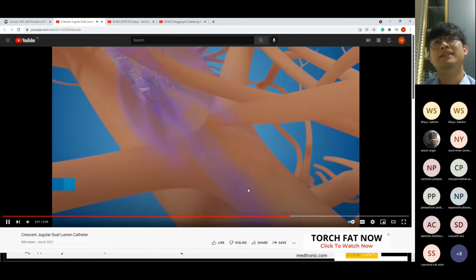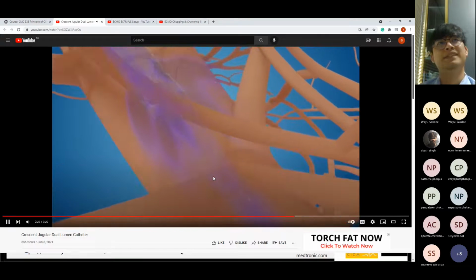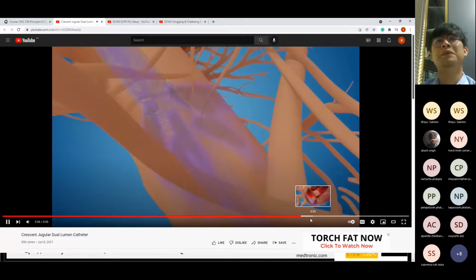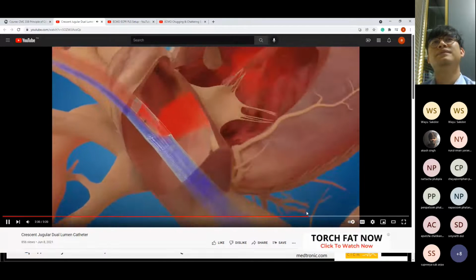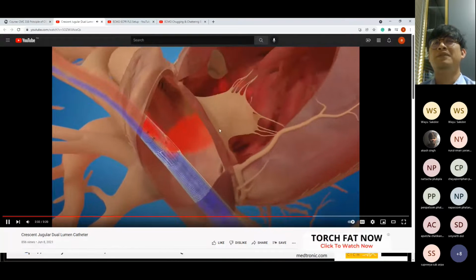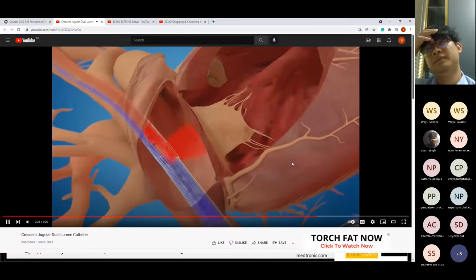And it's just the design that they show, that it's good drainage and good flow like this.